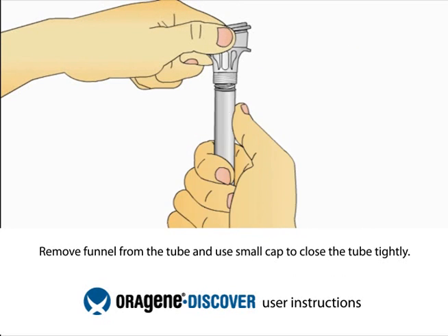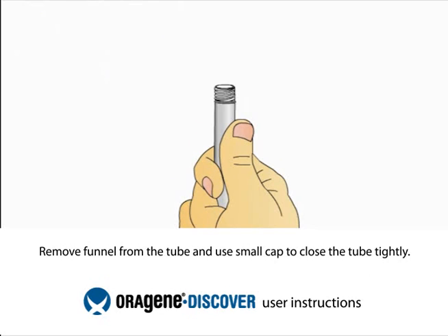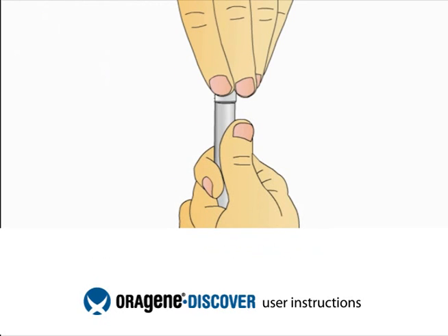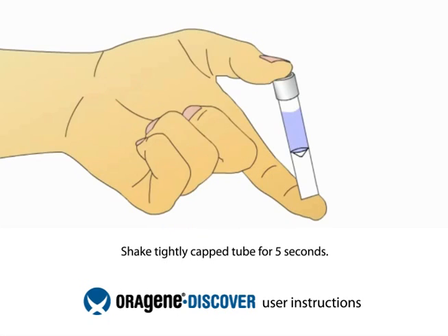Hold the tube upright. Unscrew the tube from the funnel. While keeping the tube completely upright, pick up the small cap and use it to close the tube containing your sample. Shake the capped tube for 5 seconds.